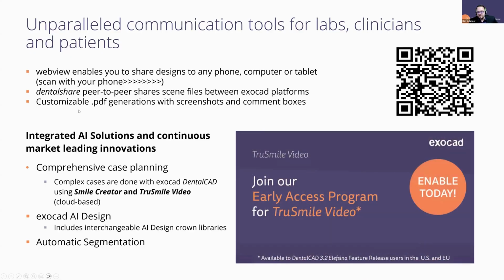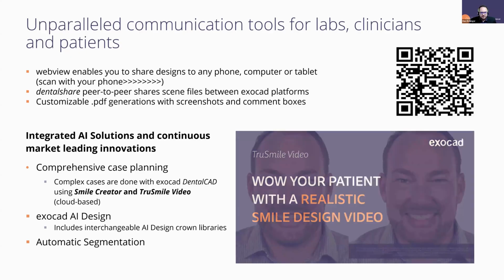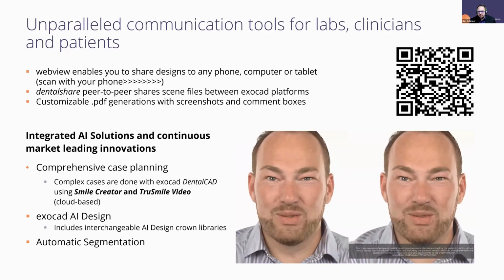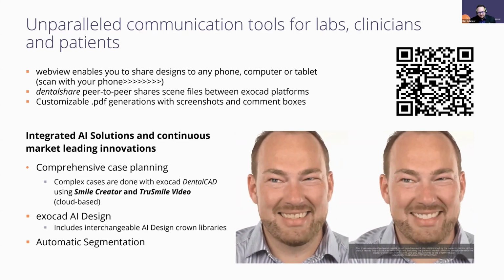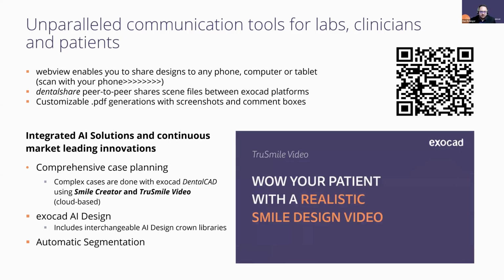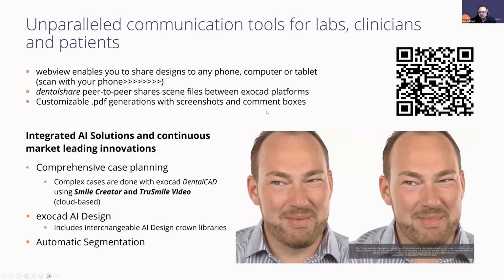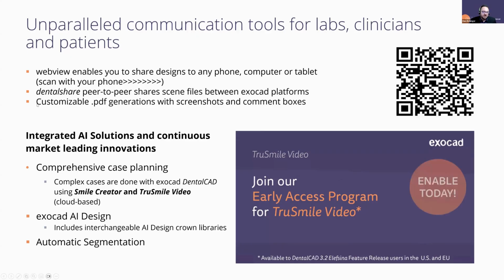Up next is Dental Share, so peer-to-peer. This truly enables collaboration from design centers, laboratories, surgical guide centers as well. So basically any service you can think of, it's a simple click of a button and you can send on to the next station.